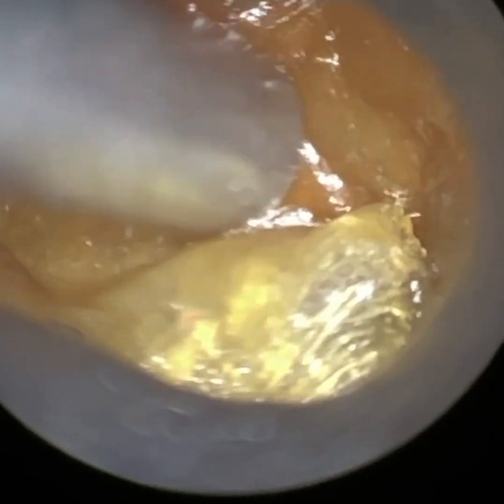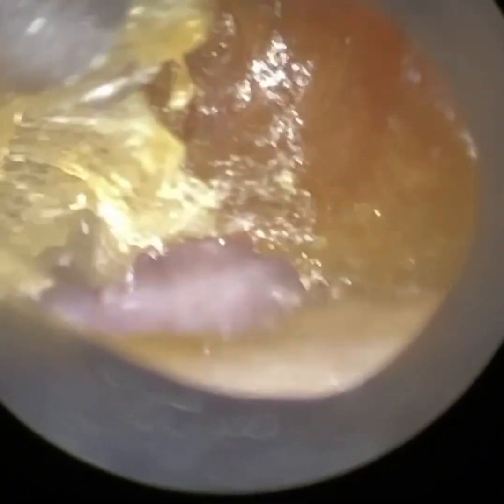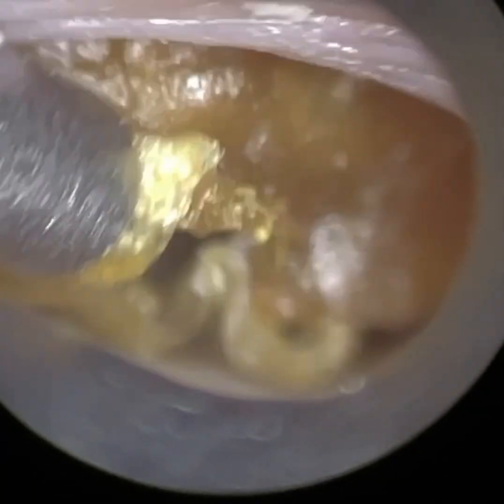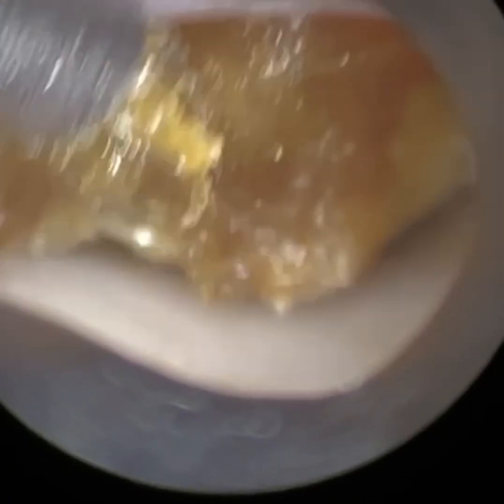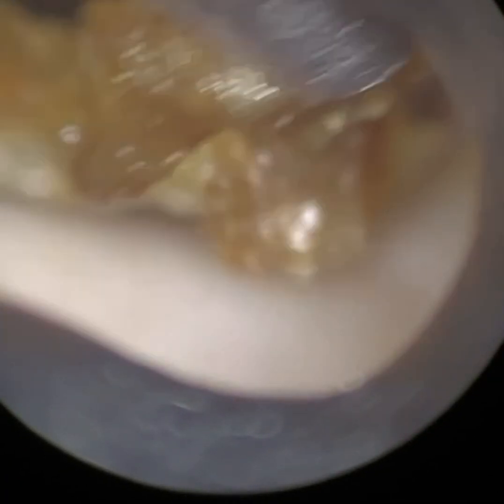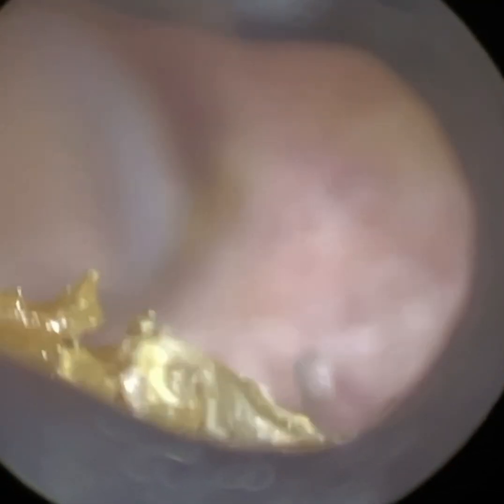The speculum is designed to dilate the ear canal, as opposed to if you're using the endoscope, where there is no speculum attachment and you're relying upon the endoscope itself. You need to acquire that skill in order to stretch and widen the ear canal as you simultaneously introduce the instrument with the opposite contralateral hand. So this is a lot more user-friendly in that respect.